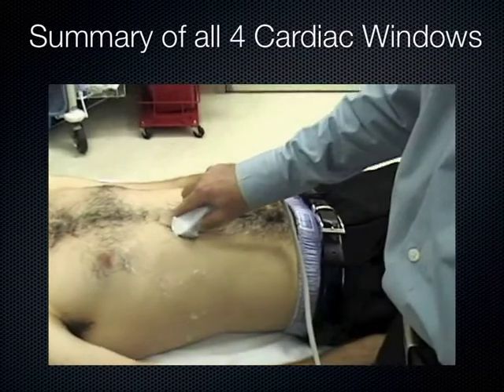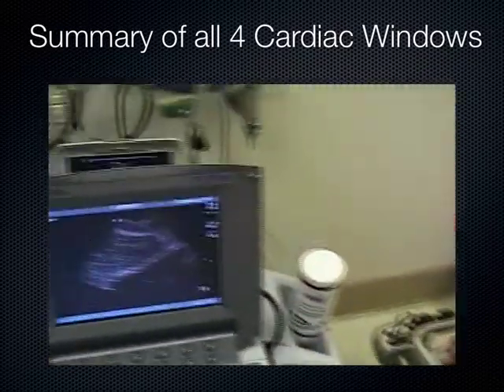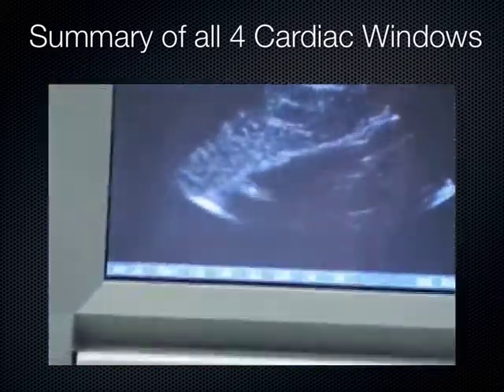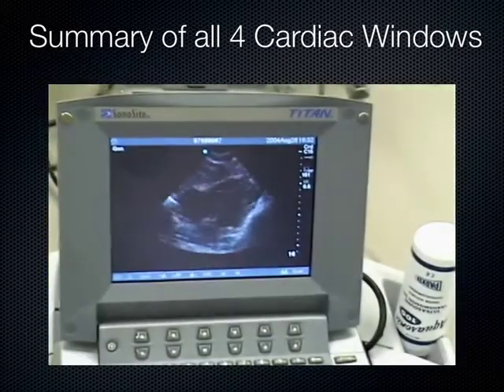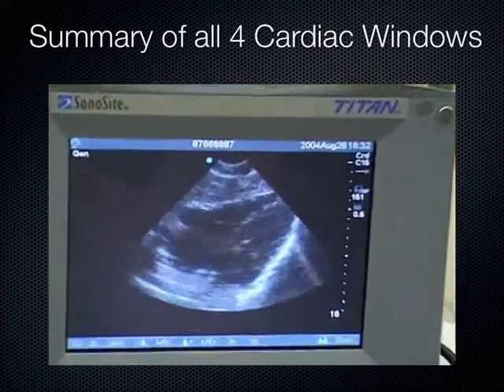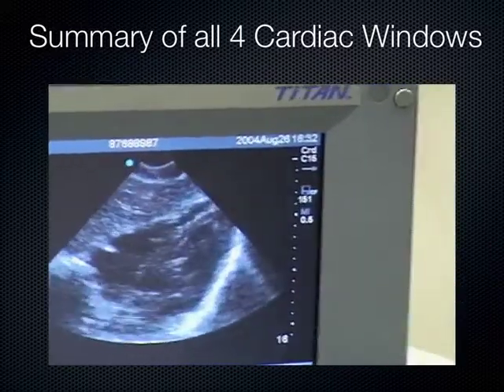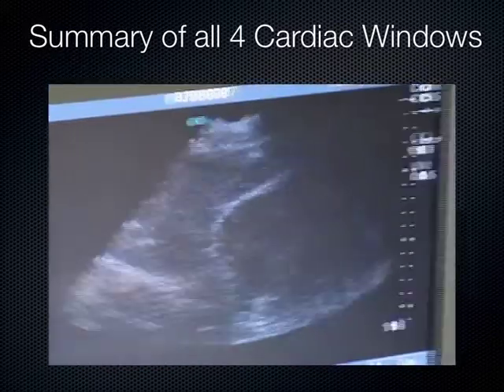Starting with the subcostal view hands-on: the depth was initially too shallow at 7.5 cm, so we need to increase depth for this view. Turning up the gain, we can see the right ventricle, left ventricle, right atrium, left atrium, and the septum. The indicator is toward the patient's right. Start at the liver and slide up into the sub-xiphoid until you see the heart — that's how you do it.